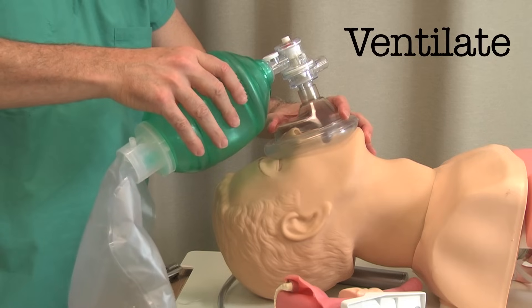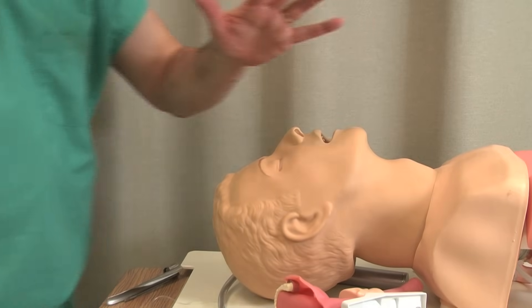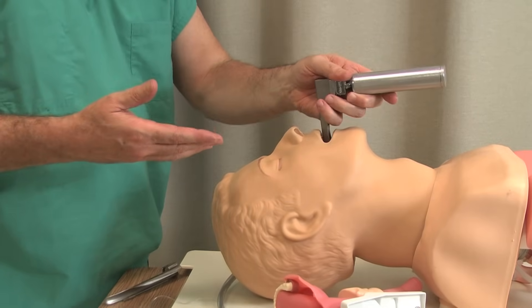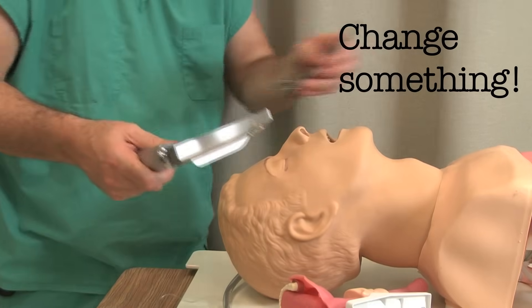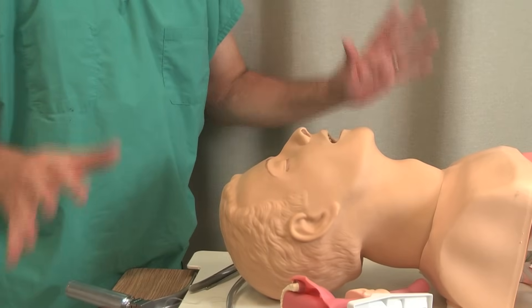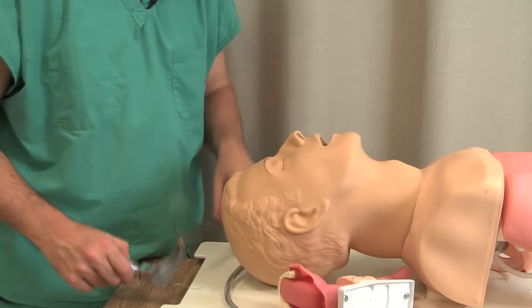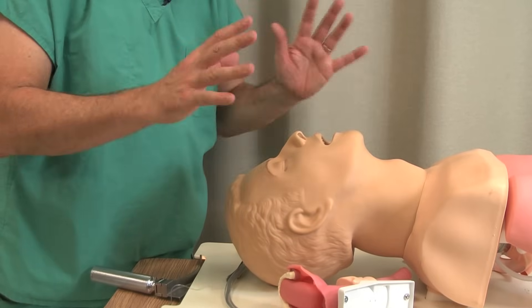Pull the laryngoscope out, give them some mask ventilation — the importance of mask ventilation. Now you've got the patient resaturated. The whole idea is: change something. Don't reinforce failure. If you have the exact same head position, exact same blade, and exact same practitioner, do you really think things are going to change? No. Change something — put their head up more, get a different blade, get a different person. Never be so proud to not ask for help. I'd rather swallow my pride than hurt a patient. Most often, head position is what does it for you.